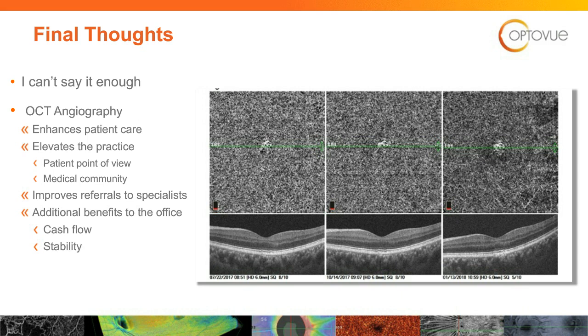Let me filter through here for another question. Do you use the Optos as a replacement for dilation? And the answer is no here. We do every single patient that we have. And I'll even fold in here and add to the question. We do not use wide field OCT to replace dilation. We don't use Optos to replace dilation. We dilate most patients. Sometimes they come in and they've had dilated last year. They haven't had any symptoms, so we don't have to dilate every year. But it does not replace dilation.